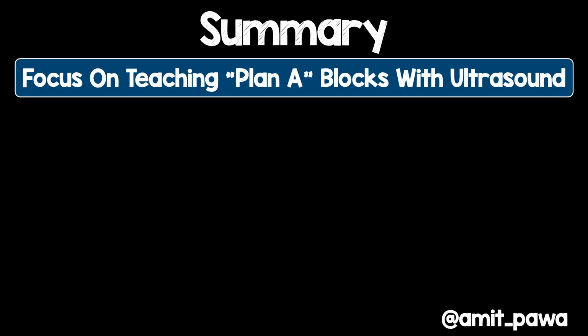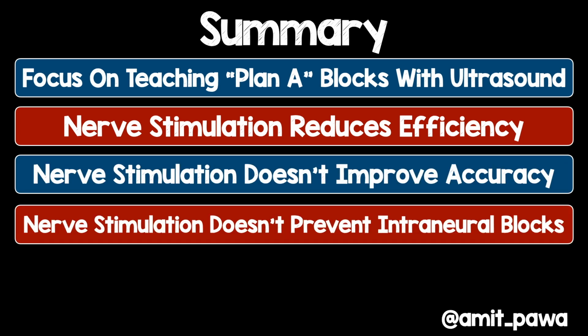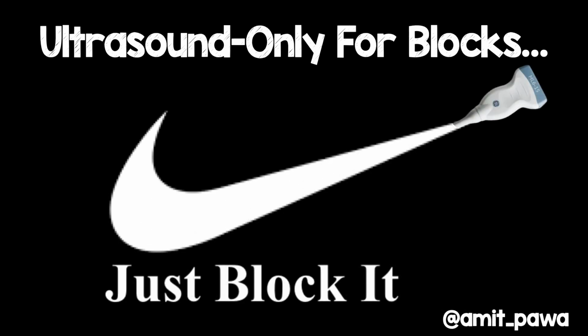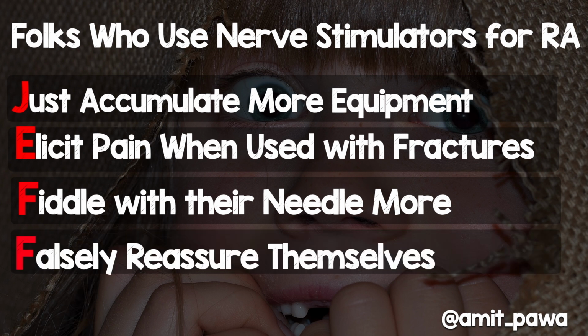So in summary, I think we need to focus on teaching Plan A blocks with ultrasound. We know now that nerve stimulation reduces efficiency, and it doesn't improve accuracy, and it certainly doesn't prevent intraneural blocks. But there may be limited utility for nerve stimulation in certain cases. Ultrasound only for blocks? Yes, we should just block it, because folks who use nerve stimulation for regional anaesthesia just accumulate more equipment. They elicit pain when they use them with patients with fractures, they fiddle with the needle a bit more, and they falsely reassure themselves.